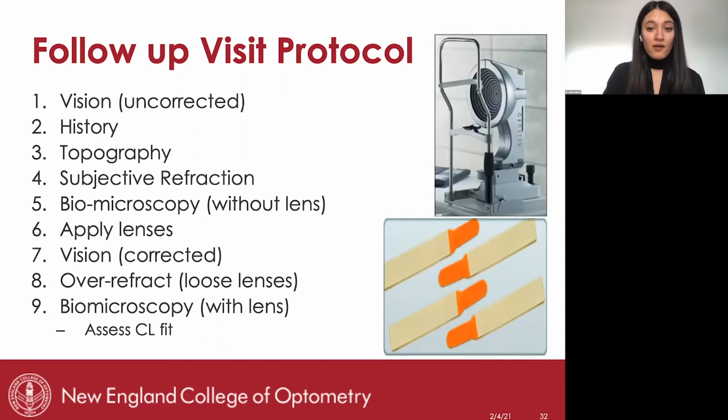Remember that at day 1 it's very unlikely that you'll see their visual acuity at 20/20, but it should be improved from baseline. Moving to day 7, it should be getting even better. By day 14, we expect that visual acuity to be right on target at 20/20.